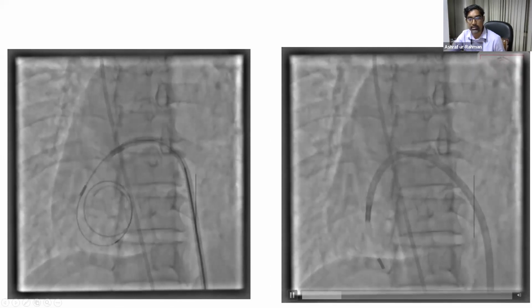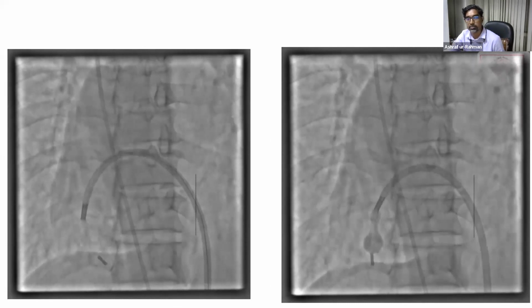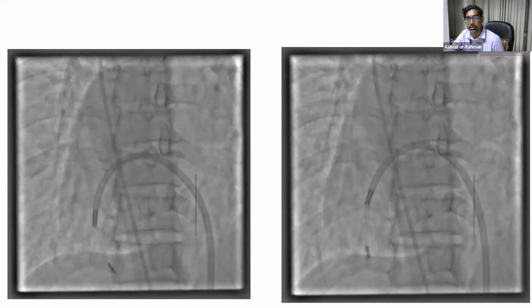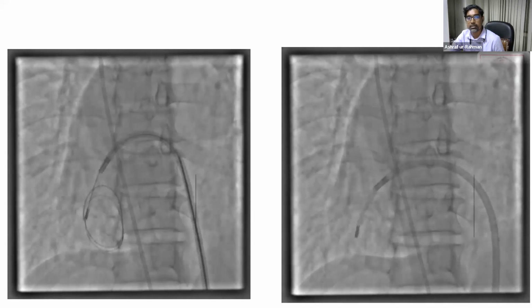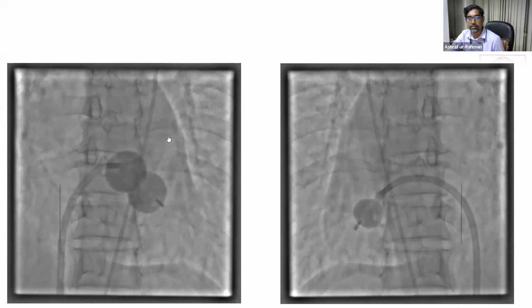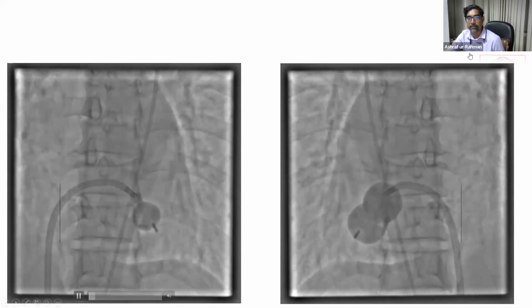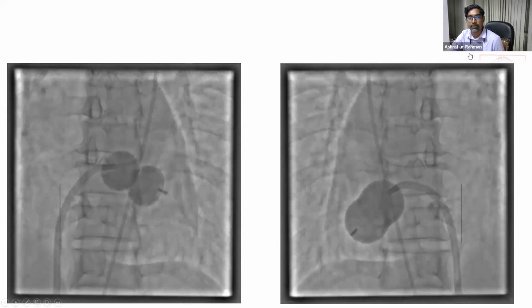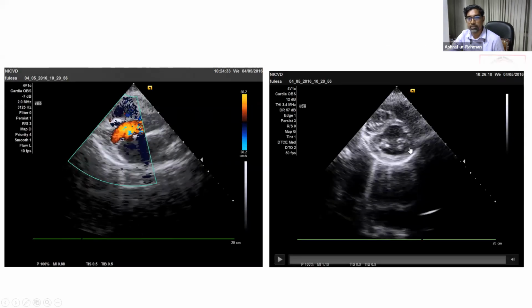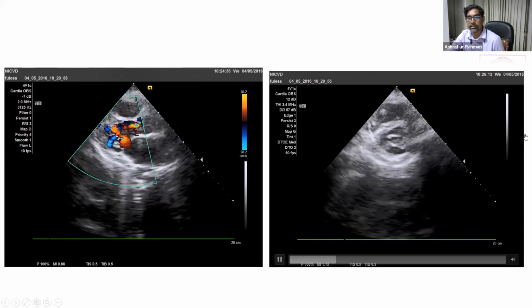And we searched the literature. There were about eight case reports of PTMC in dextrocardia patients over the world. The procedure is being completed. This is the reversal of the fluoro image. The PTMC was successful in the dextrocardia patient, and there is commissural splitting.